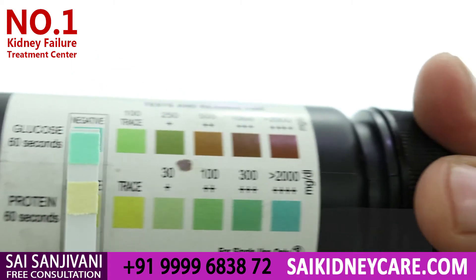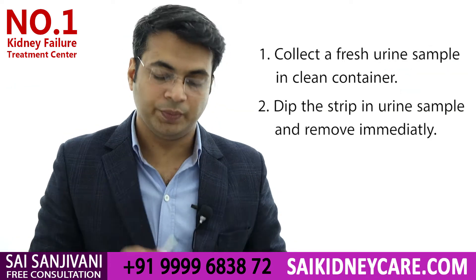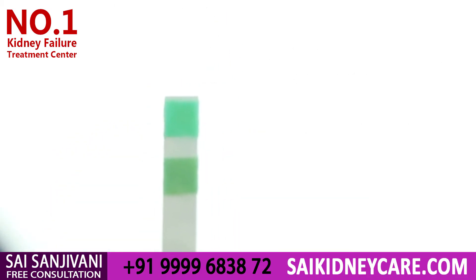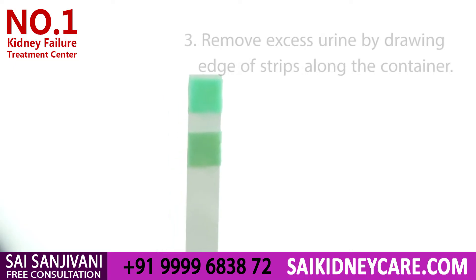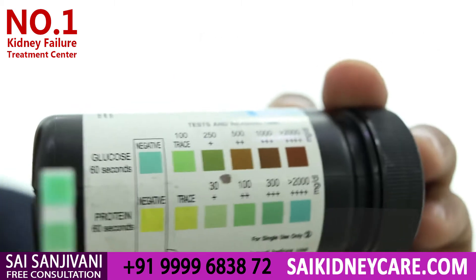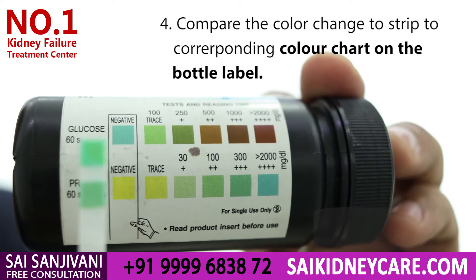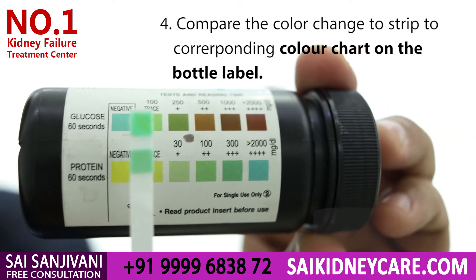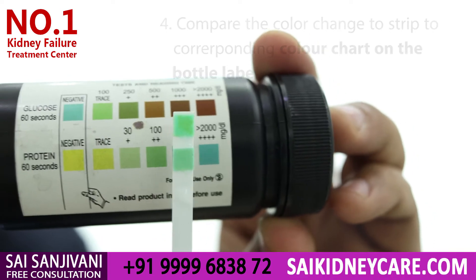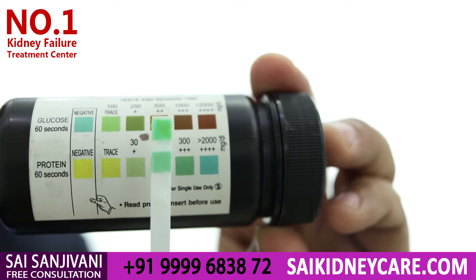For testing purposes I am using a pure sample of albumin. Let's dip this strip into the urine sample. After dipping the strip for a few seconds, you can see the color of the strip has changed from yellow to green. If we compare it with the chart, you can clearly see that the protein pad of the strip has changed to green, and it comes nearby somewhere here — that means the protein is high.